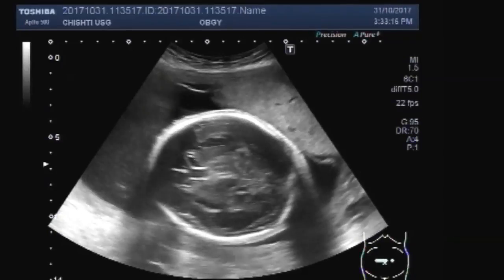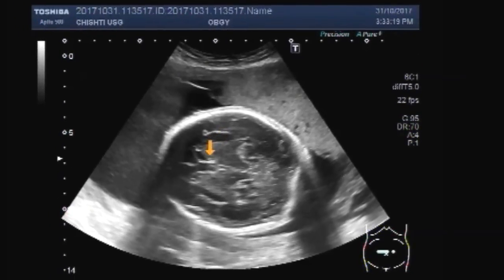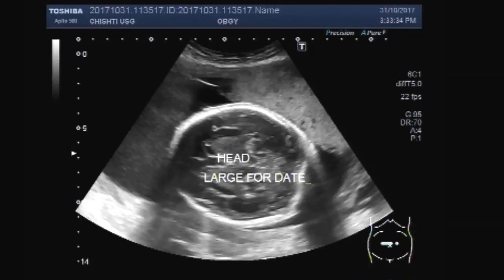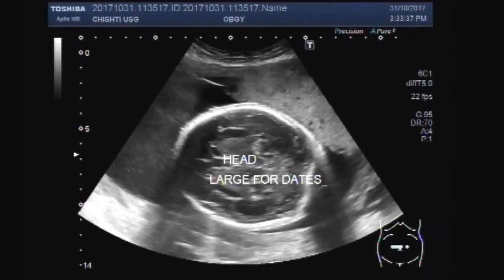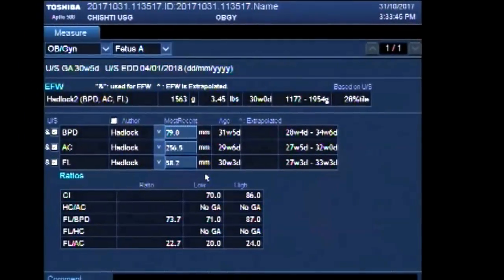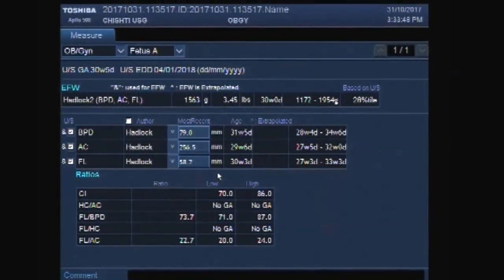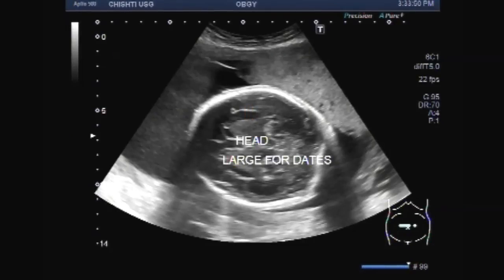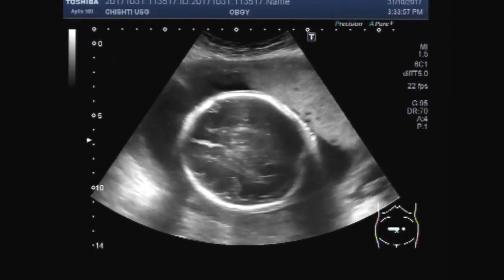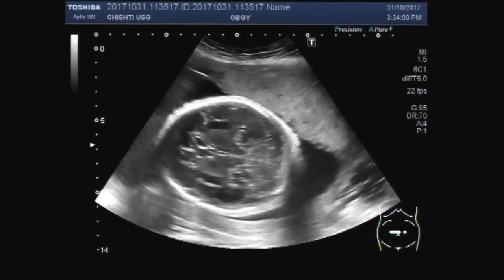Now you can see the head of the fetus. The ventricles are dilated and the head is slightly large for dates. You can see the measurement of the fetal age by different methods.